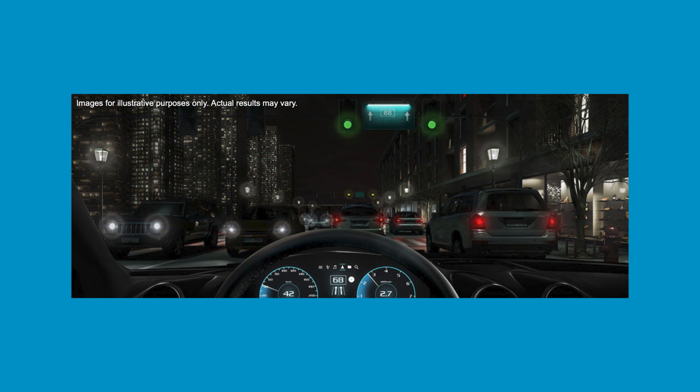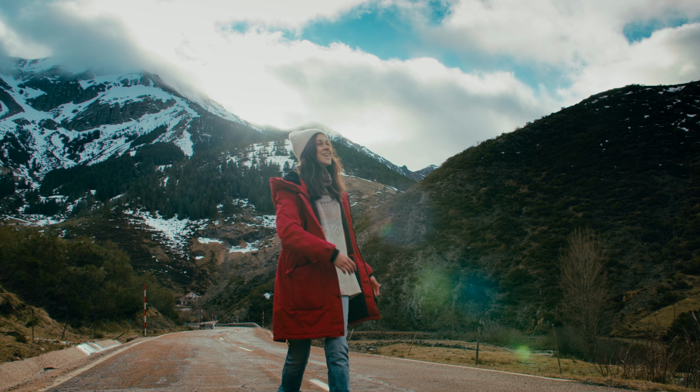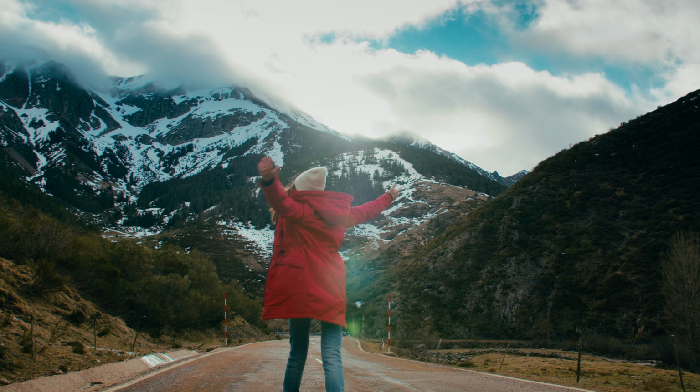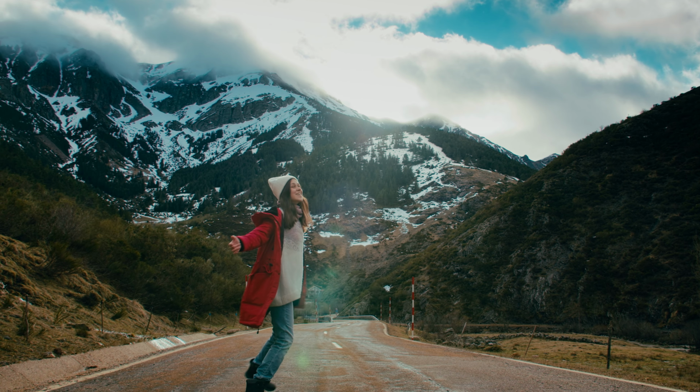When it's dark or at night, you may see halos or glare around lights due to the way the lens works, but our brain does a really good job of adapting to this. The multifocal strategy is best for patients who really wish to be as independent from glasses as they possibly can be.